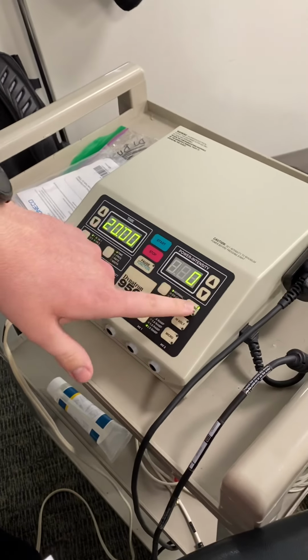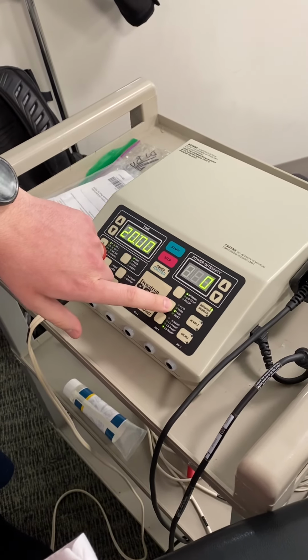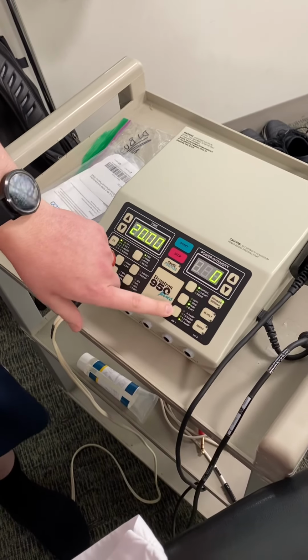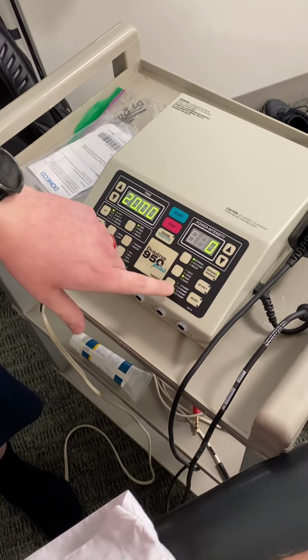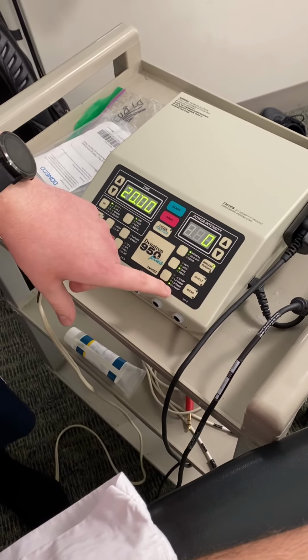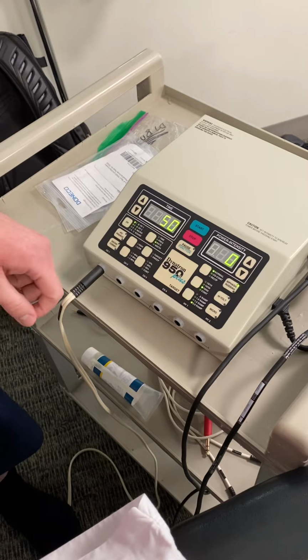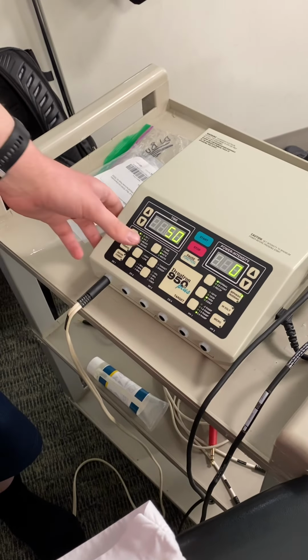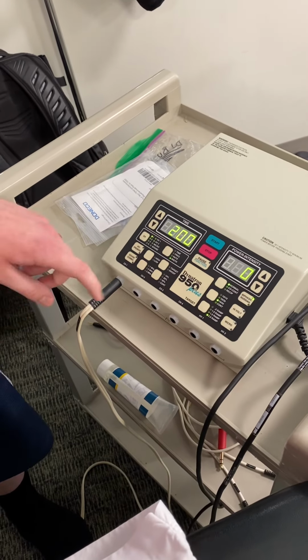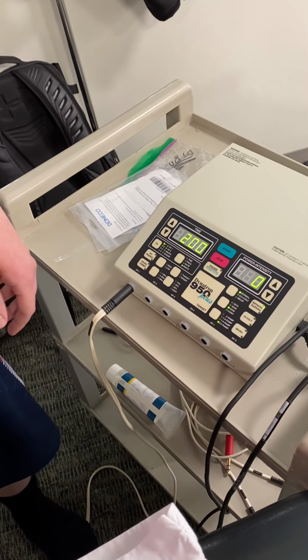I'm going to press biphasic, which I've already done, and then I'm going to switch it to a 10:50 duty cycle because I want to get one contraction for every minute. It's going to be easier for me to remember how many times he's doing a contraction, and I'm also going to turn it up to a 2-second ramp because I don't want him to be hit really quickly with the electrical stimulation. And then over here I want his rate at 50 pulses per second, which is okay with me, and then a width of 200 microseconds on the pulses is the ideal pulse width for trying to activate those muscle fibers.